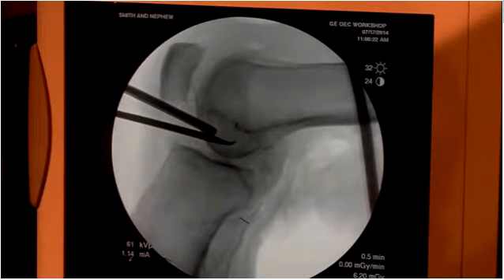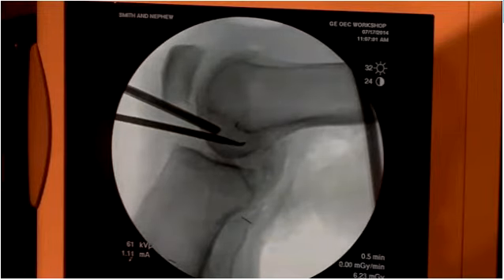Okay, is that the fluoro? Yes. Okay, all right. So that's where the AM is, and you can see this specimen has a large posterior condylar osteophyte. So there's your AM, center of the AM. The center of the PL, I would say, is about here.